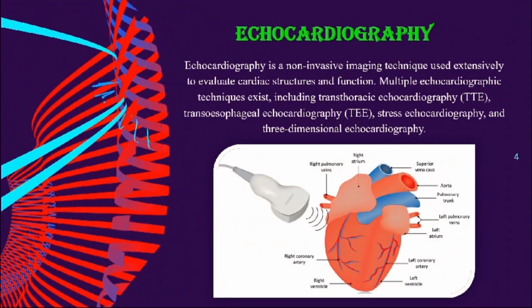Echocardiography. Echocardiography is a non-invasive imaging technique used extensively to evaluate cardiac structures and function. Multiple echocardiographic techniques exist, including transthoracic echocardiography, transesophageal echocardiography, stress and three-dimensional echocardiography.